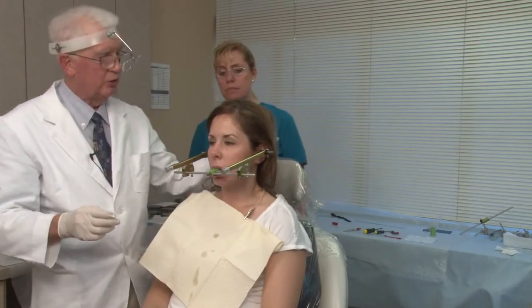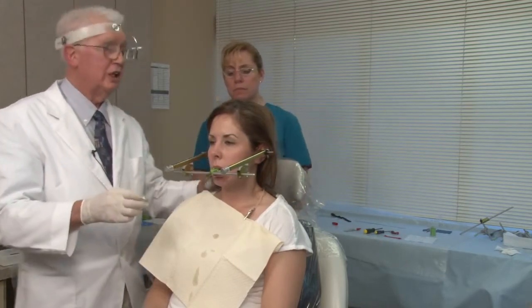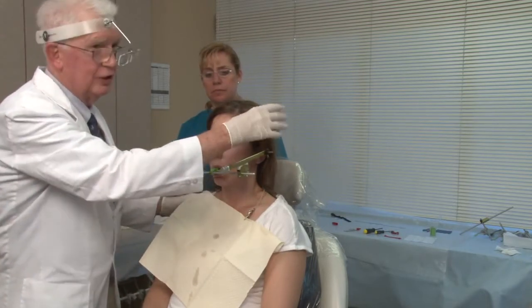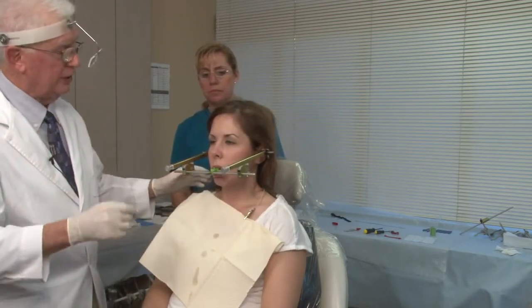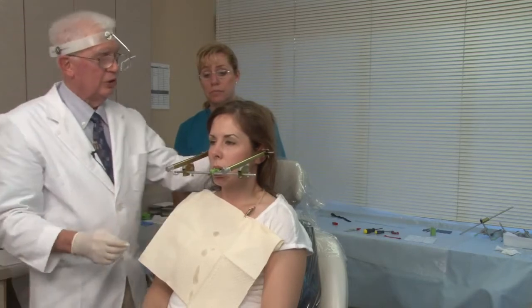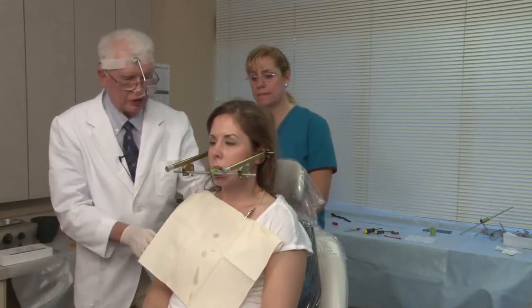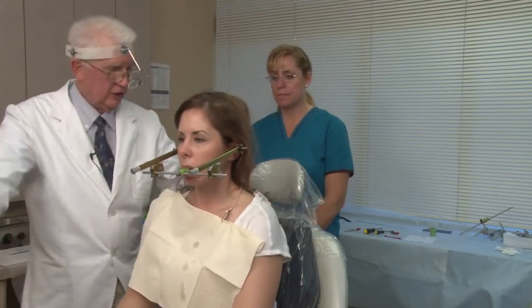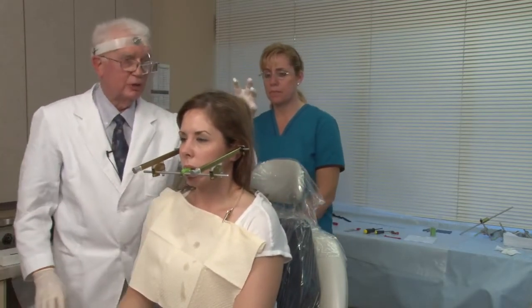If there are any hair bows, bobby pins, anything in the hair, they have to remove it, and the hair has to be completely loose. And then I will have the patient sit up. Now it's out of the chair, that's a girl. Look straight ahead. I will come in and I'll support the back of the head.